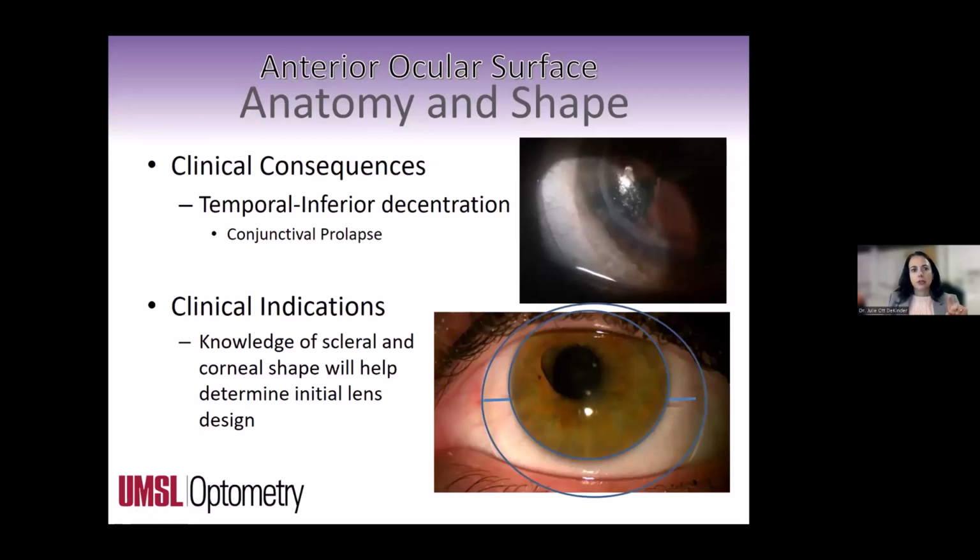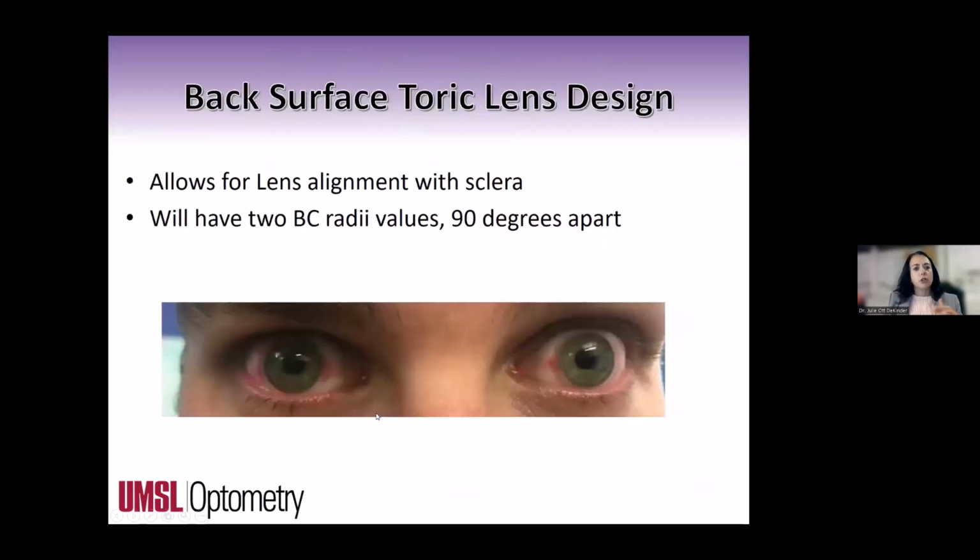And in a second, I'll talk to you about how I know how much I like to tighten this up, because you're going to have to be a little bit aggressive here. And I think that being not aggressive is kind of a folly sometimes as practitioners. So we can be very aggressive and not be too concerned about it.